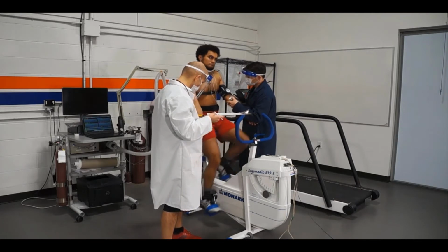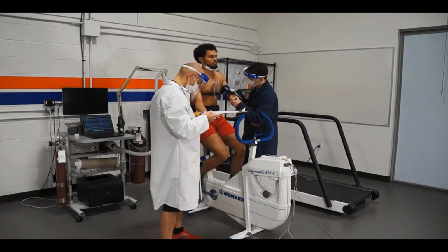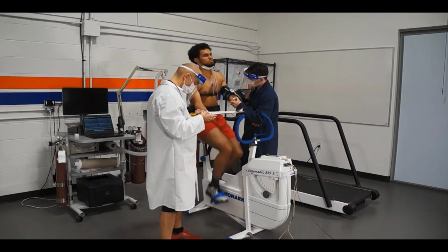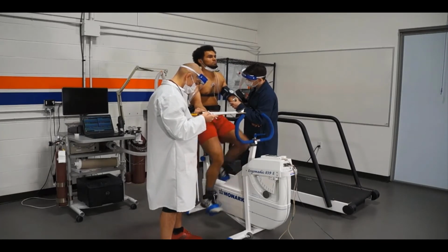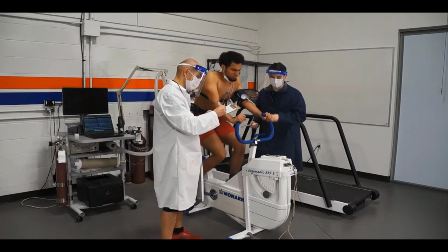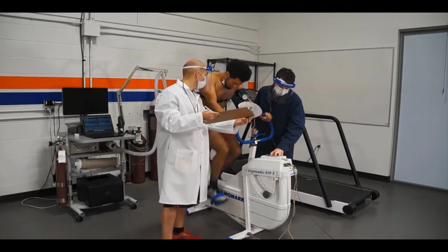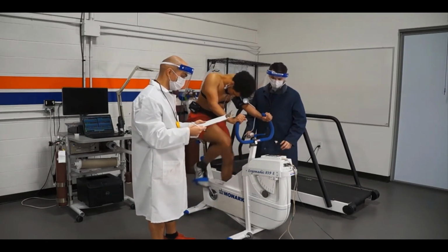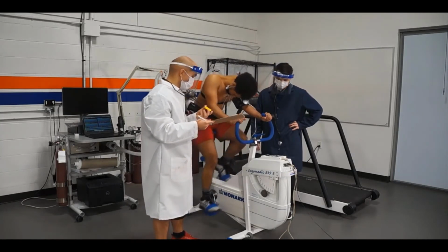We take our measurements to try and not make the participant as uncomfortable as possible. You can see that even though he's got both arms out here, it's a fairly light workload. As he gets towards the harder workloads, it's definitely going to get more cumbersome for us to be grabbing both arms and him to not sort of be grounded and really sort of forcing his legs down. Really sort of waddling in the saddle towards the end. But yeah, we take 15 seconds or whatever that is, get our measurements as accurately as possible, ask RPE, Nick asks RPE while I'm increasing the workload, and then that's it. And then your participant's good for about another minute 30 in that workload.